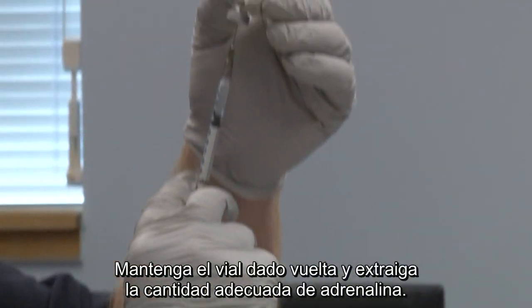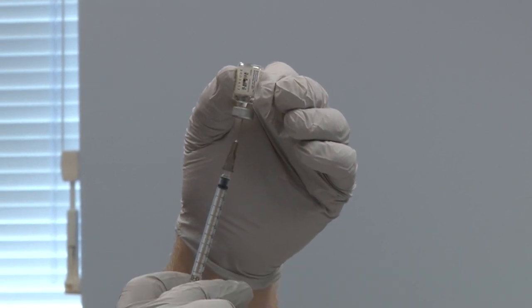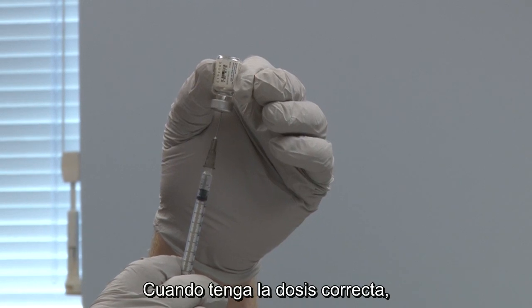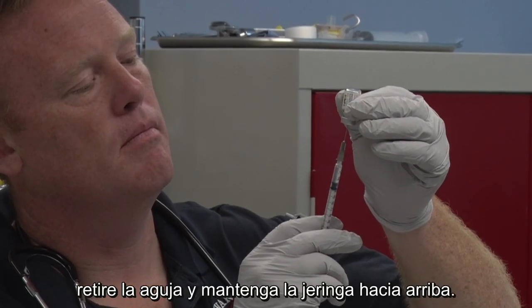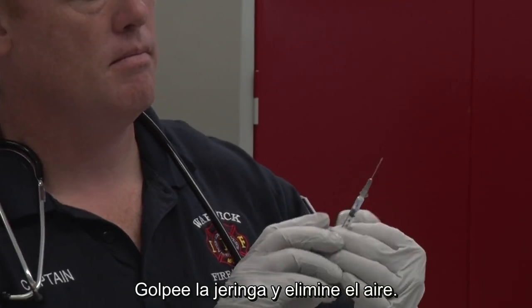Hold the vial upside down and withdraw the proper amount of epinephrine. When you have the correct dose, withdraw the needle and hold the syringe facing up. Tap the syringe and remove any air.